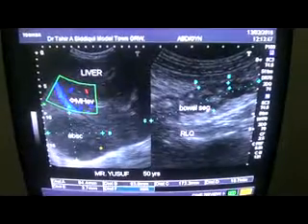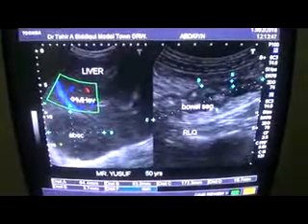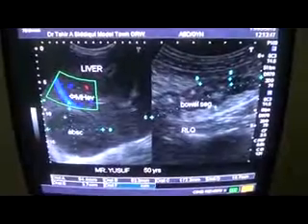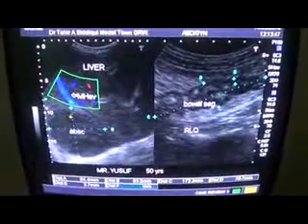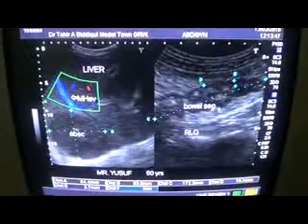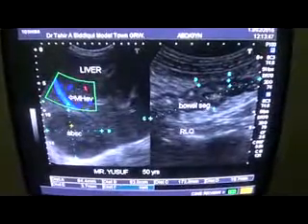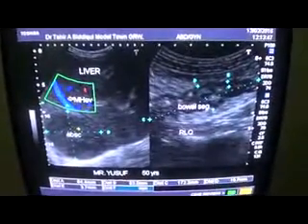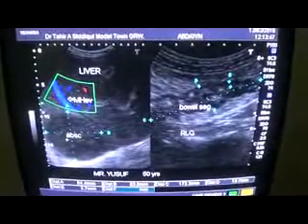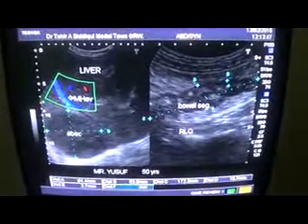healing phase pathology. Now, if one has to drain this abscess, we'll have to use a wide bore needle. This is the importance of informing the referring doctor or surgeon, so that he may know that the material within the pathological lesion is thick enough that it needs a wide bore needle if the surgeon wants to aspirate it. Now, this is the middle hepatic vein.